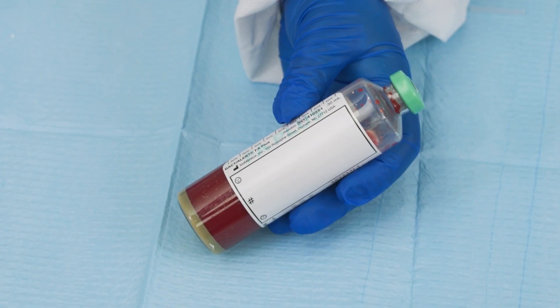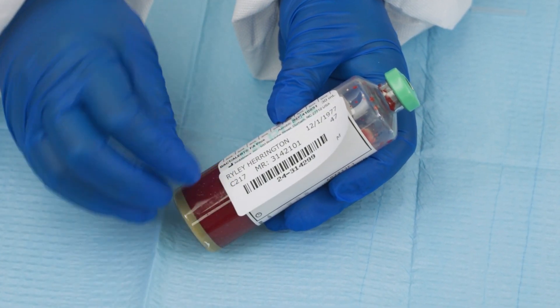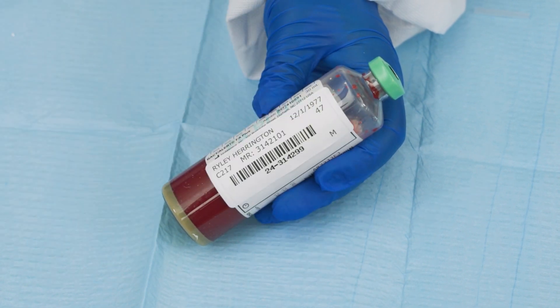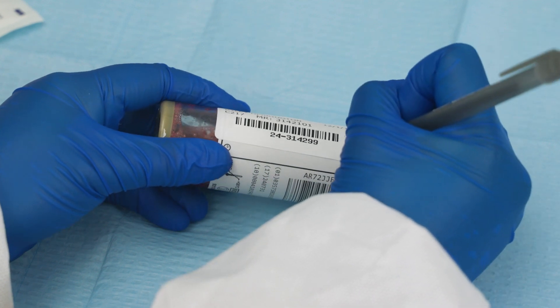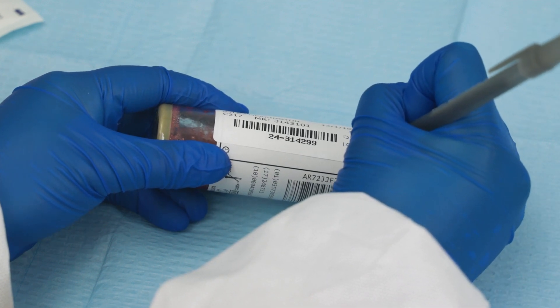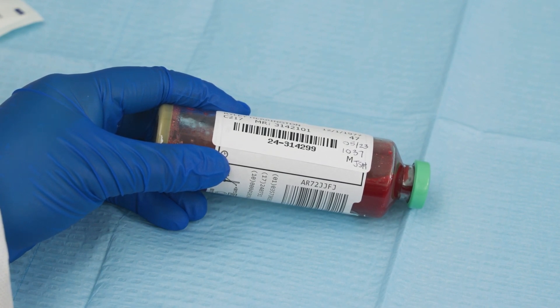To properly label the bottle, use the dedicated area on the bottle. If using a test label, place the barcode label vertically so the orientation is the same as the bottle barcode. Do not cover any of the bottle barcodes, the fill tube mark, or the window to check the blood level. Add any additional information if required, such as date, time, and collected by. Ensure that any additional labels do not cover the bottle barcode.